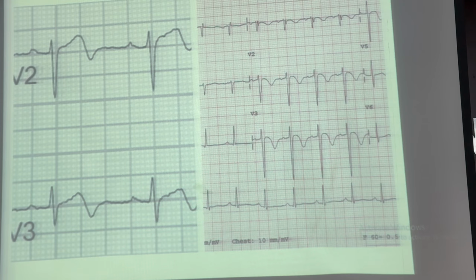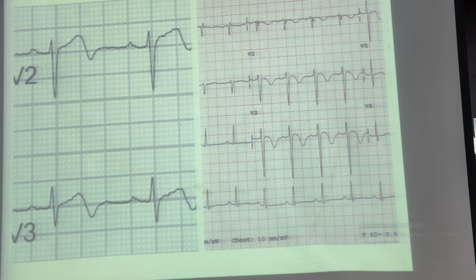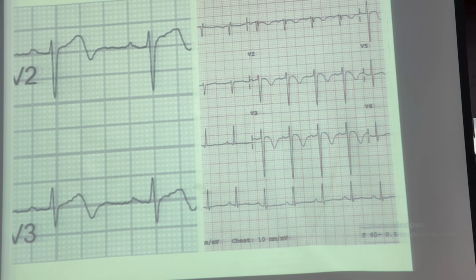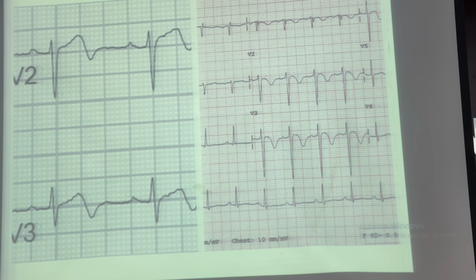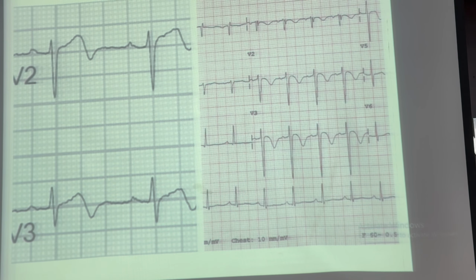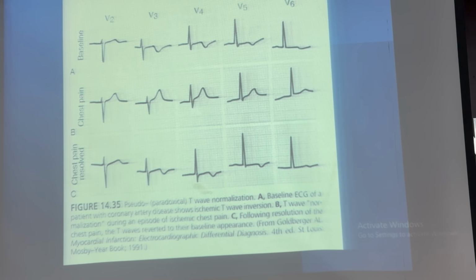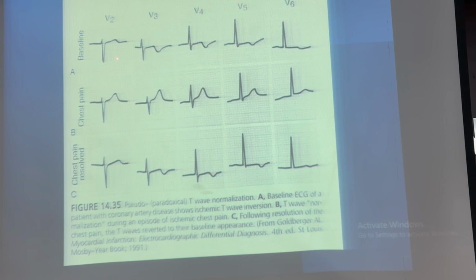The third thing is the troponin. Usually the troponin is normal. If you have a high sensitivity troponin, it may be marginally elevated. So Wellens doesn't give a very high troponin. If you have this abnormality and very high troponin, then it's something else, right? Then the fourth thing, we have the luxury of doing an echo, and we could see some wall motion abnormalities associated with Wellens, right? And the other important thing, Wellens ECGs appear when the patient is symptom free.